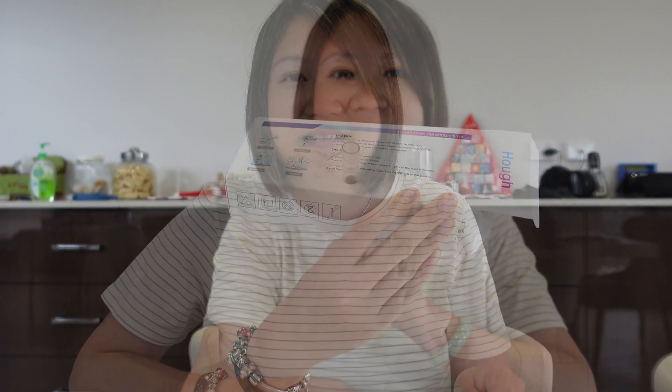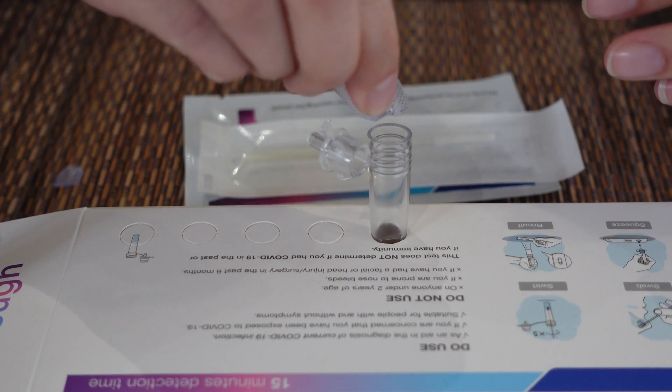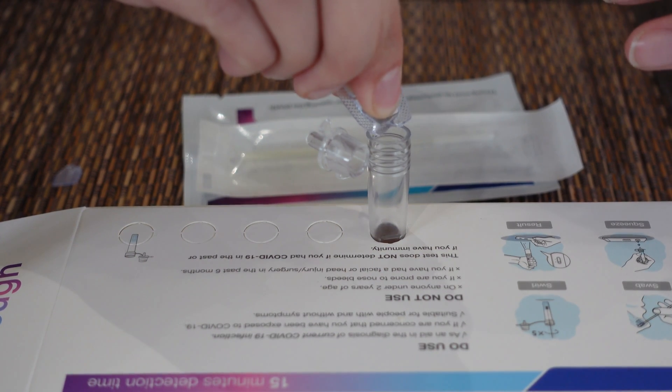Like this. So next, you get one of these, and you break it and pour it into the tube in here. This is how you do it. And I'm going to dip in here, like this.